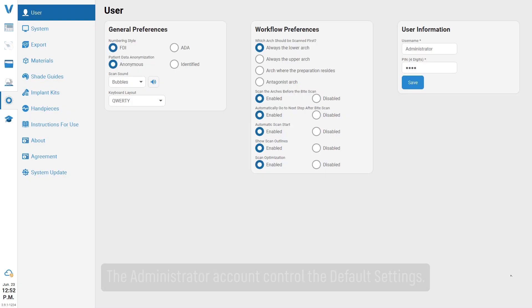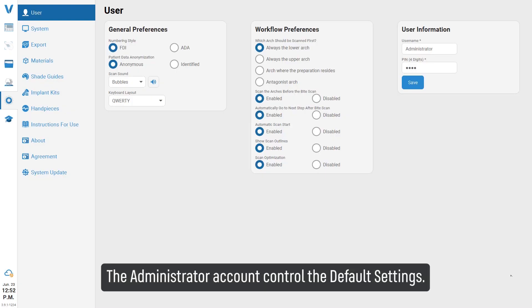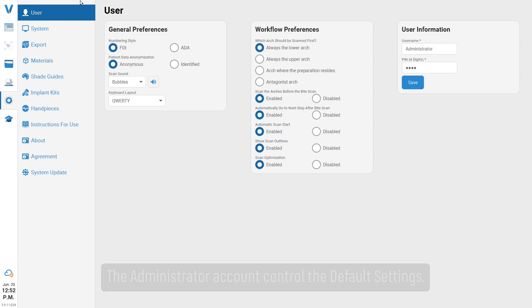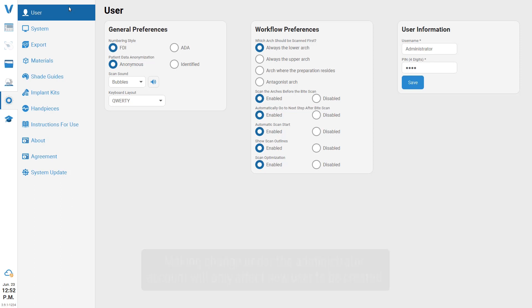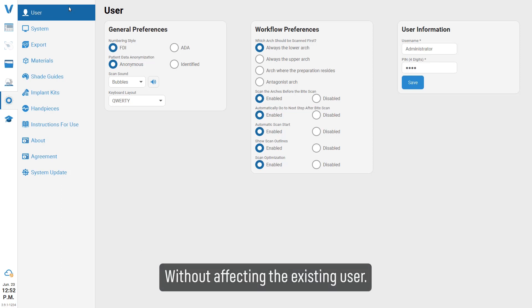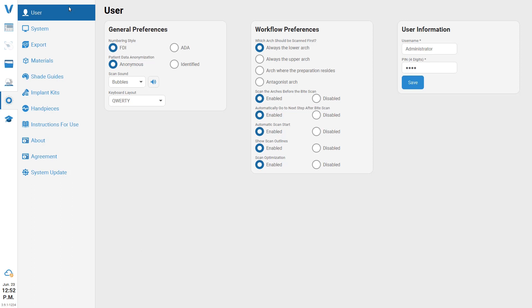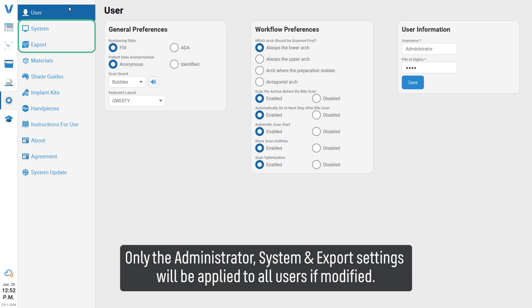The administrator account controls the default settings. Making changes under the administrator account will only affect new users to be created, without affecting existing users. Only the administrator system and export settings will be applied to all users if modified.